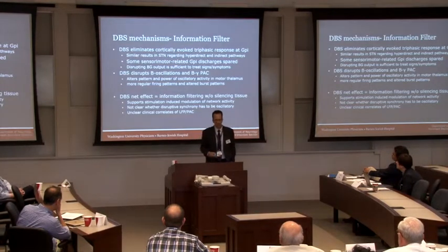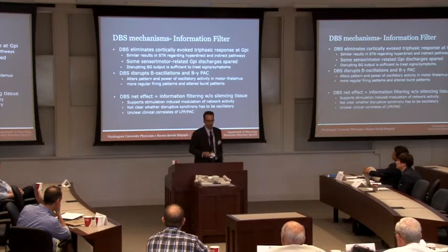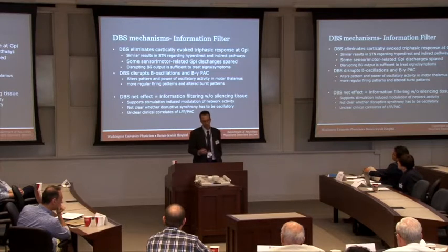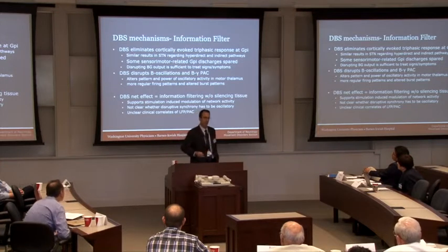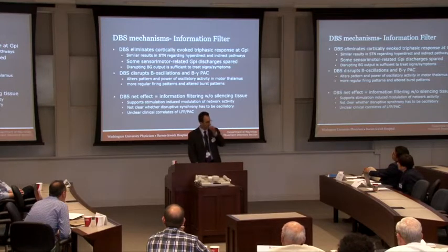So thinking about DBS and eliminating the cortically evoked triphasic response that I talked about, how does this affect the circuit at the local level? Maybe it doesn't matter. DBS disrupts those beta oscillations, alters the power, and creates a more regular firing pattern. The point I want to make, and I've already made this, but I want to reiterate, is that this is in the context of a single symptom of Parkinson's disease, bradykinesia.